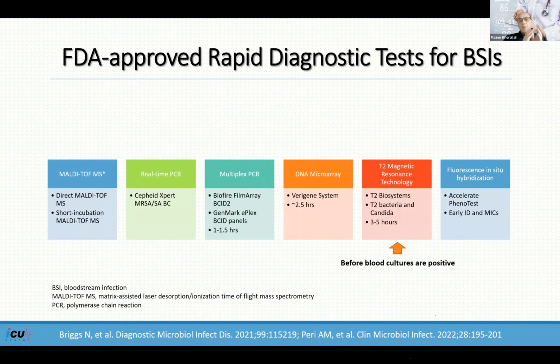And the third specimen that you can get for rapid diagnostic testing would be the blood. So again, you get a nasopharyngeal swab, you get sputum or BAL, and you run it through the multiplex PCR, and then you can choose a diagnostic test for the blood. We have different techniques for detecting, or let's just say identifying, the bacteria in the blood.